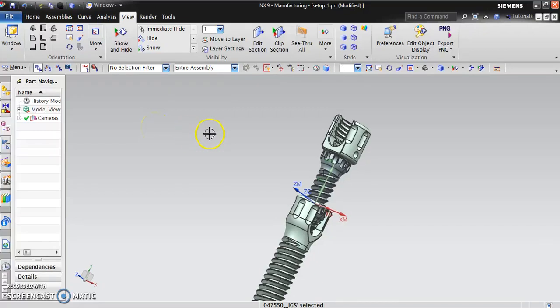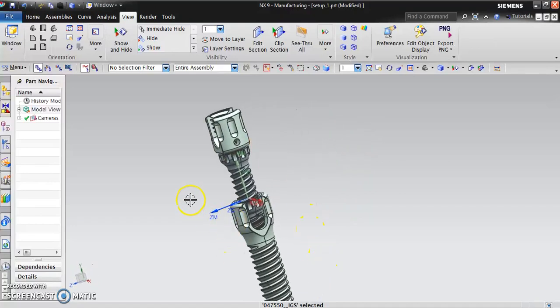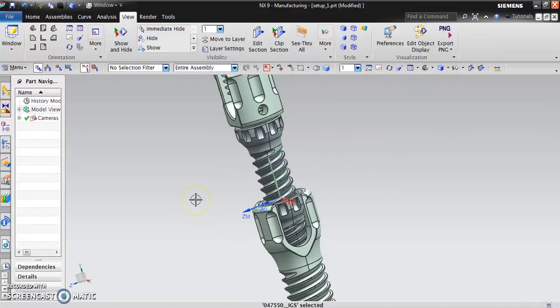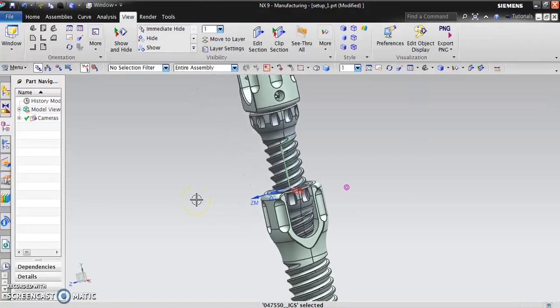Hello all, welcome. In this video we'll look at how to make spinal implant components. Last video series we looked at how dental implants are made. As you can see on the screen, I have 4 components pulled in for one of the common spinal implant systems. The common spinal implant system we are looking at today is a pedicle screw and rod system.